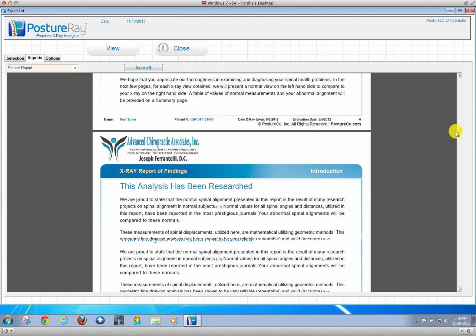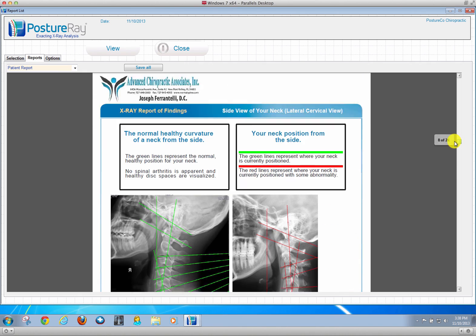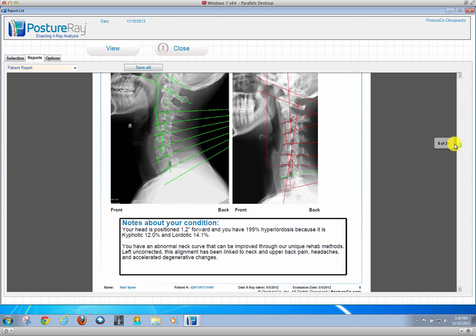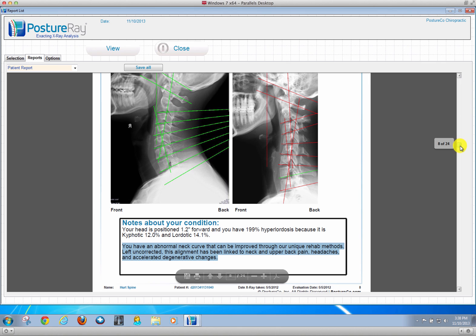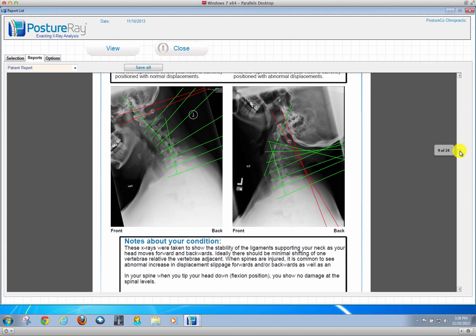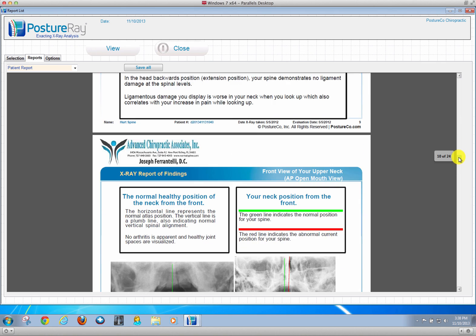Then we're going to go right into normal versus them. The Clear technique analysis automatically generates where their head is positioned, and the educational moment that we're going to do for the patient. We can go through all the x-ray views to educate the patient. How awesome is that?